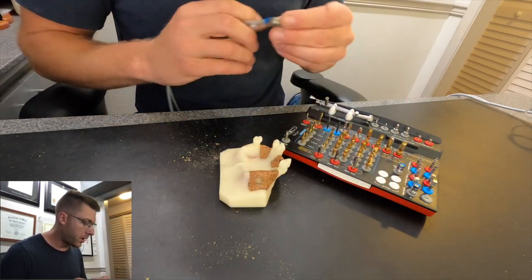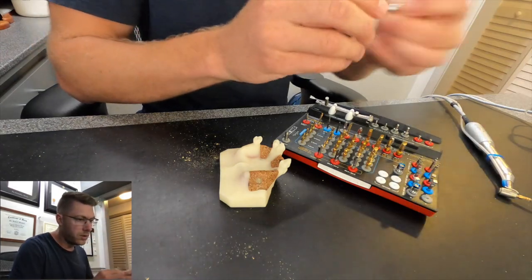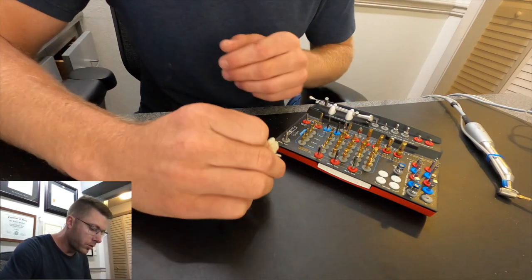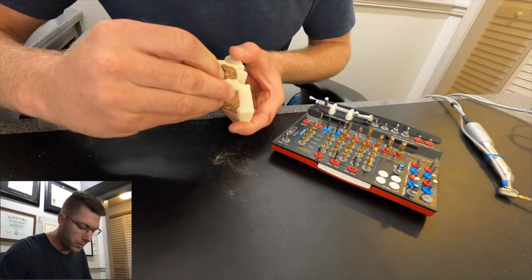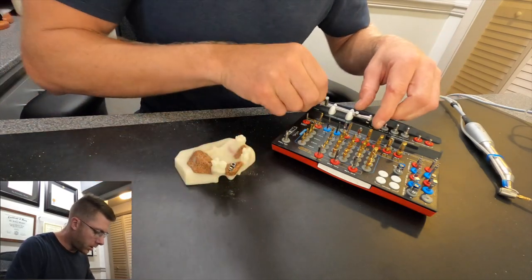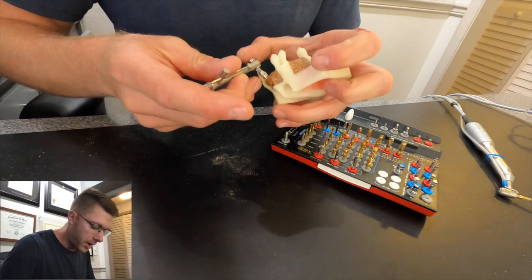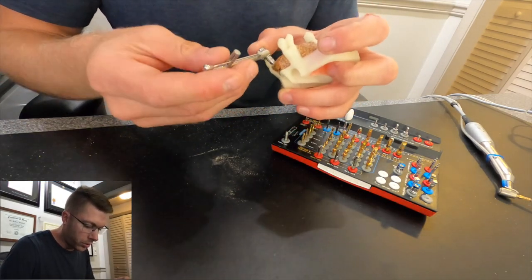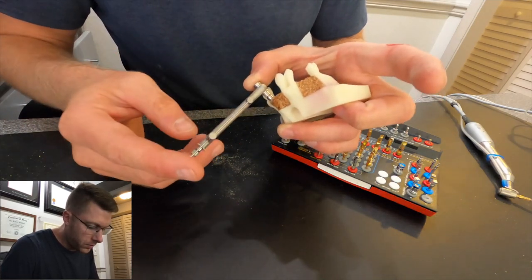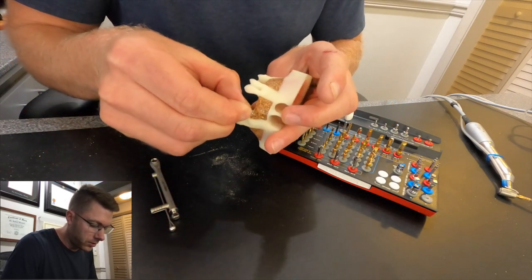I'm going to back this out and now we are going to tap the hole. I have a tap here — no different than the ones you guys have seen or used before. This is going to screw down into the bone to prepare it for the implant threads. It goes down in like that. I can give it a little extra torque if needed. This particular tap is a 3.7, so I'm really only threading the bottom. Once I feel it tight, I back it out with my fingers — and now it is time to place the implant.